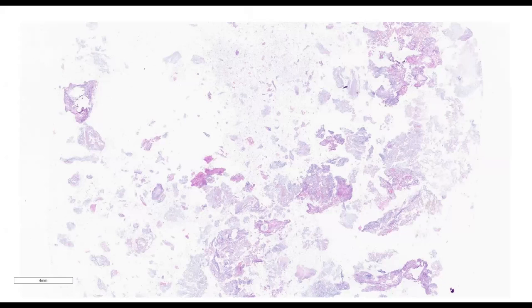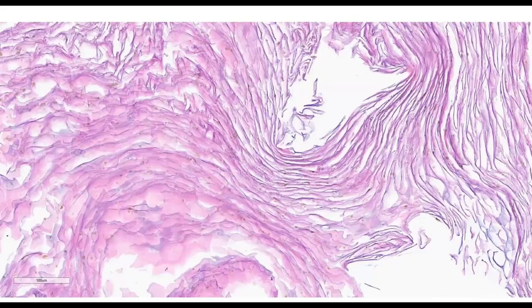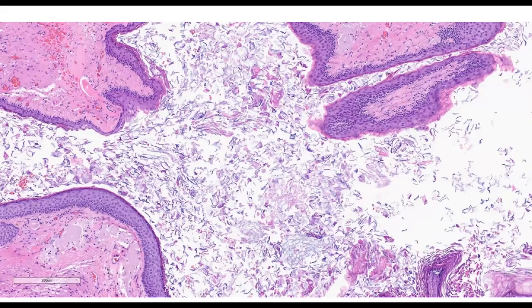There were four or five FFPE blocks from this tumor. It was completely resected, gross total resection. Four of the five blocks looked exactly like this. All right. Those are anucleate flat squamous cells. Yes. The center of this lesion is pure squamous anucleate epithelium. That's like epidermoid.